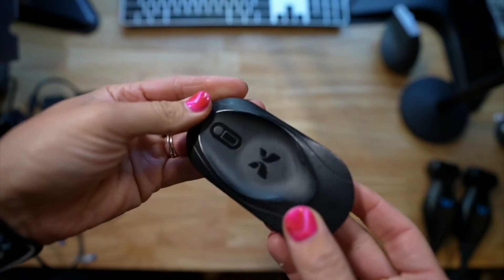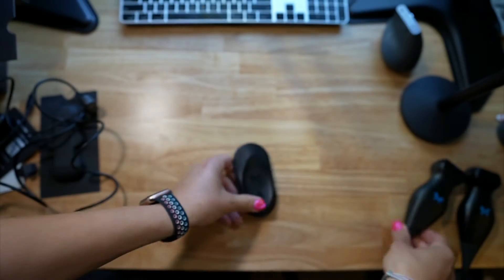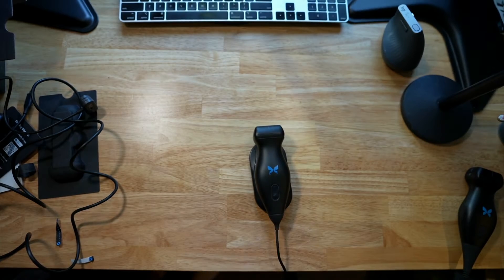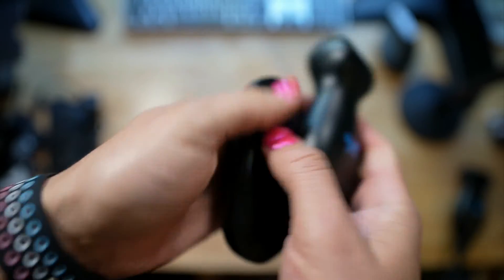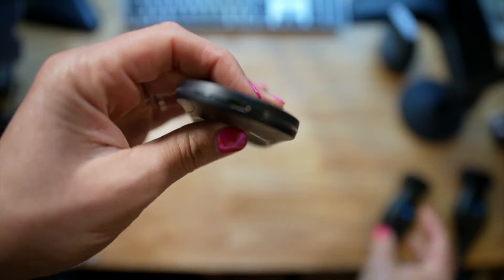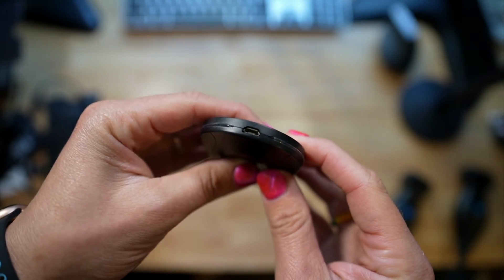So this is the old charger — you just put the transducer on there like this. It fits kind of like that, which wasn't that bad. You just have to walk around with this thing, and it had a mini USB port on it.